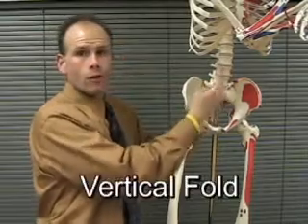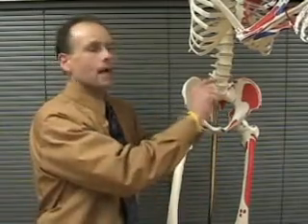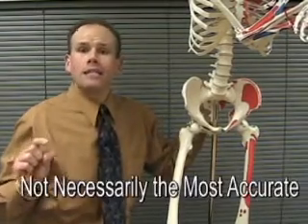2 centimeters to the right of the umbilicus, we take a vertical fold. In many people, the skin will want to fold in that vertical way. In some people, and with some other equations besides the Jackson and Pollock, they actually ask for a horizontal fold at the umbilicus. It has been my personal experience, and I've done no research studies on this, that taking a fold in the direction that the skin wants to fold in usually gets you the easiest measurement.